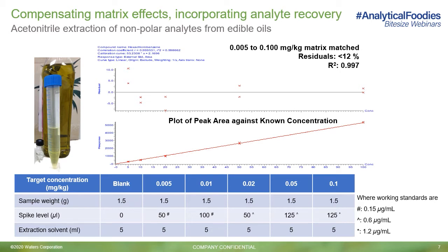As we've discussed previously, we want to keep all additions as consistent as possible, so as not to influence matrix variability between replicates. Of course, because we're spiking the weighed sample prior to extraction, we do see an increase in the amount of analytical standard, solvent and consumables used, and the time for sample preparation. However, depending on the analyte to commodity group under analysis and access to appropriate isotopically labeled internal standards, procedural calibration may be the right fit for your laboratory workflow.